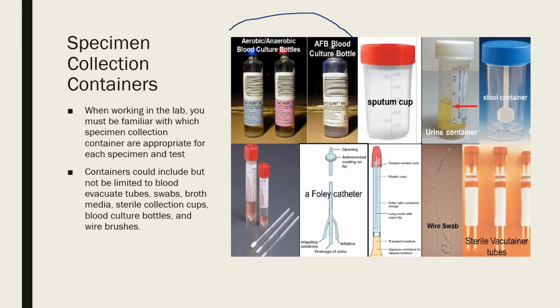The AFB blood culture bottle is looking for acid-fast bacteria. So your bacteria require different things in order to survive. Making sure you collect in the proper bottles is going to give you the best chances overall of detecting what could potentially be making that patient sick.